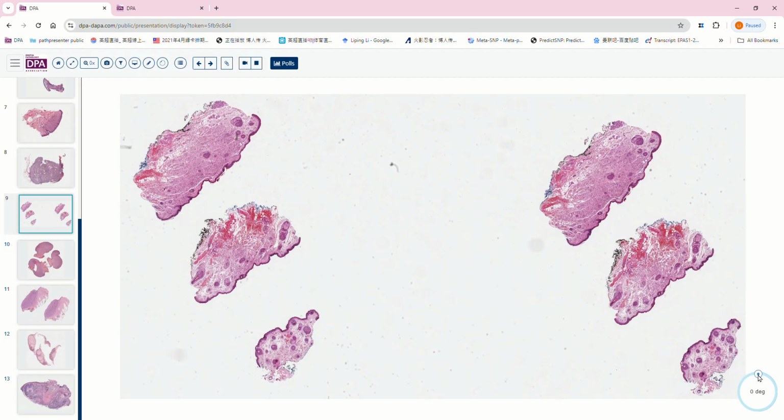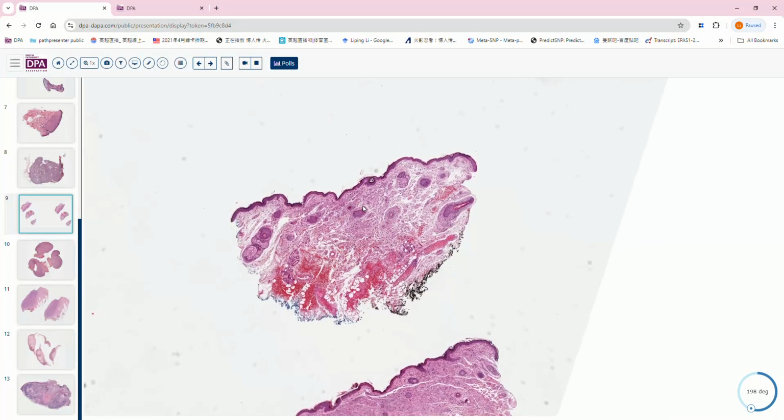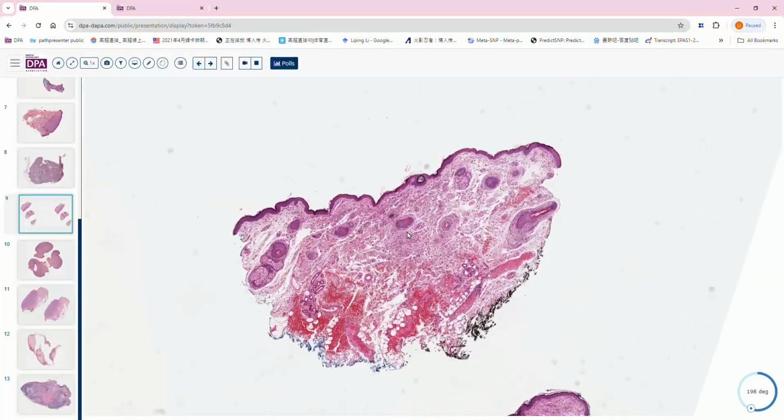Yeah, so even if I didn't tell you the location, you can figure it out because it's really thin skin. Usually in the skin, you will have more dermis and then you will have fat. But in this one, the dermis is just really thin. And then we can see this white space, because in the eyelid there is really loose skin. So you can see this space, kind of edema. But you can just imagine your eyelid, it should be really loose skin.